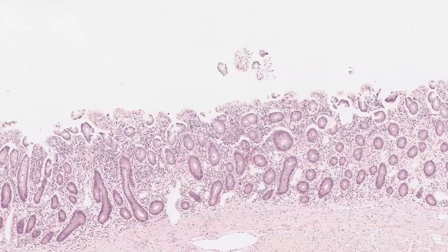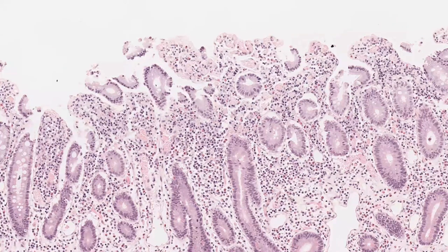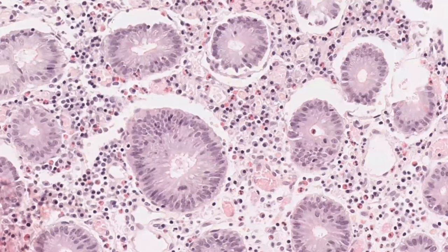You have some crypt bifurcation appears frequent. You have some crypt oblique alignment. Okay, you can see the surface is not very happy in this biopsy, for example. So you look at the inflammation itself, it looks okay. There isn't really any kind of pyloric metaplasia here. Slightly, we will argue a lot with the inflammation anyway, reactive epithelial changes indicative of constant regeneration of this area, which we said about the bifurcation, but you can see it as well in the epithelium with the loss of goblet cells, okay, that diminishing the number of goblet cells. So all of these are regenerative features that we will consider. It's kind of like non-specific in a way, okay?